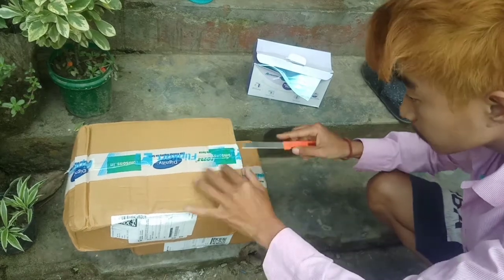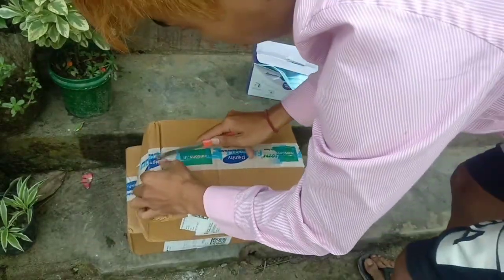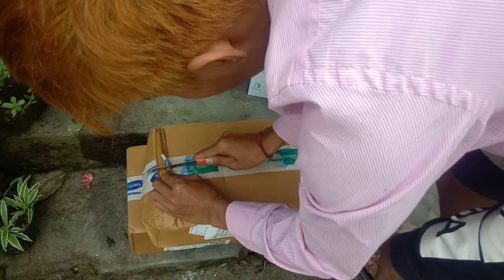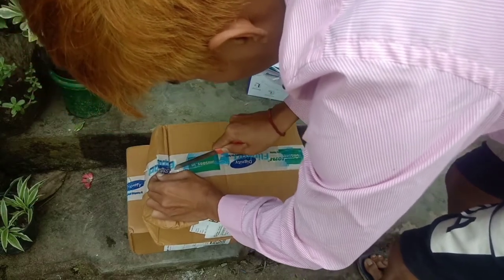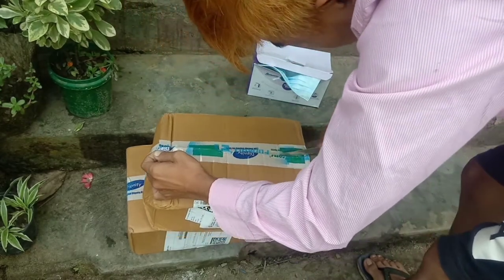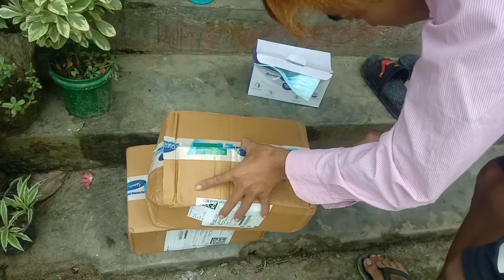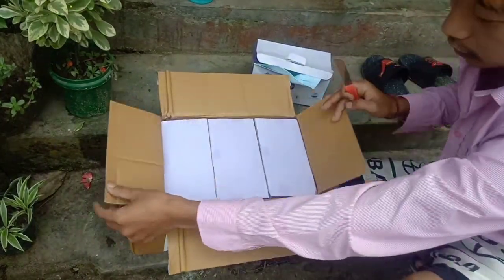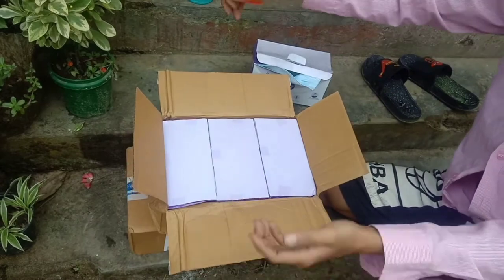I already use this brand and I really support it — it is really, really comfortable and I hope you guys try it too. It is the cheapest mask which is actually good in the market, so do try it. This box costs 670 rupees, which is like 10 dollars.